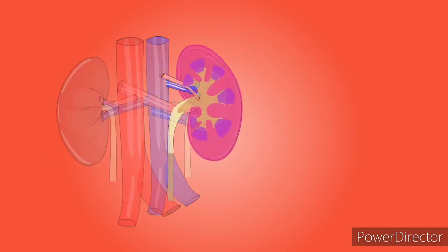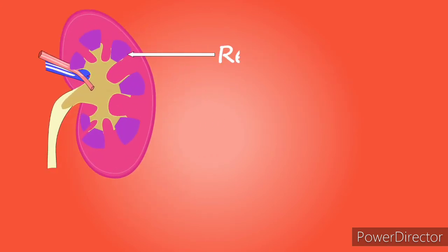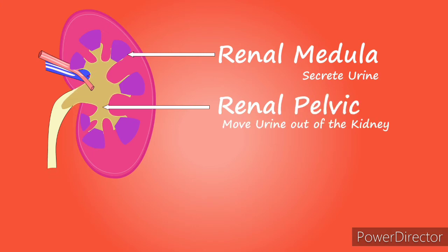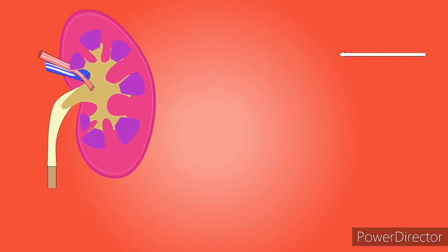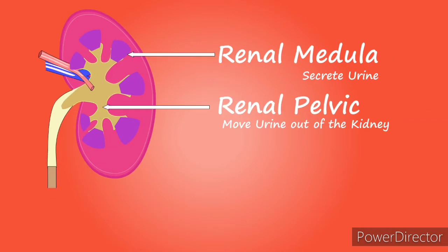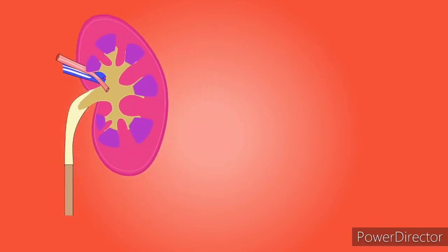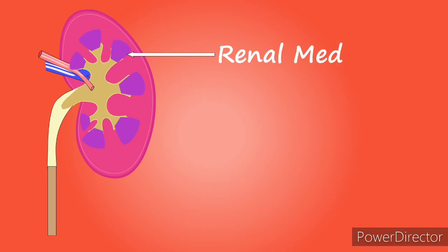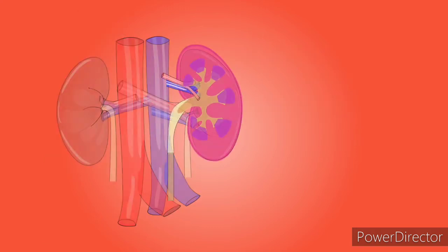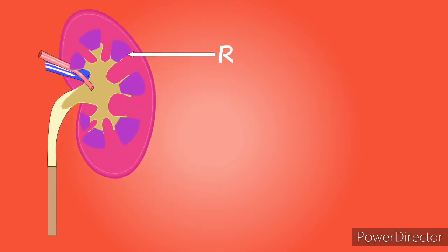So this urine analysis is being divided into three. We have the physical examination, the chemical examination, and microscopy examination. When it comes to physical examination, you check the color of the urine, the transparency, the odor, and you also check for the volume and specific gravity.